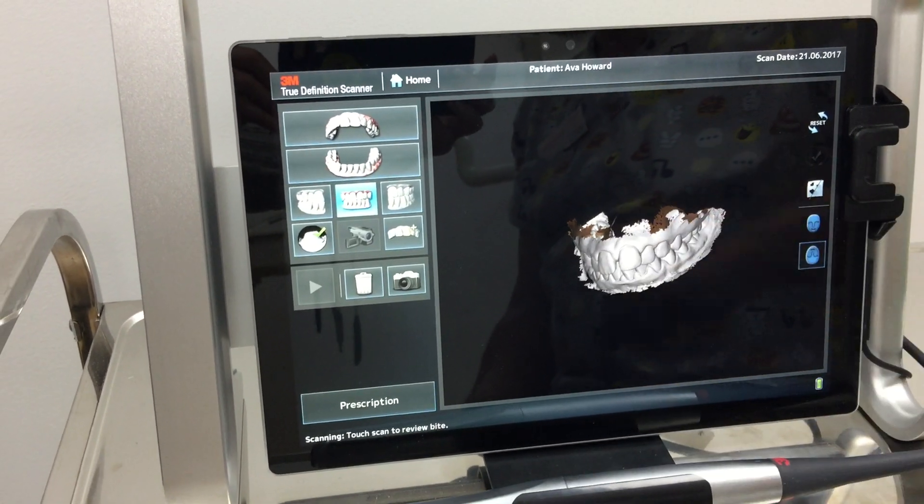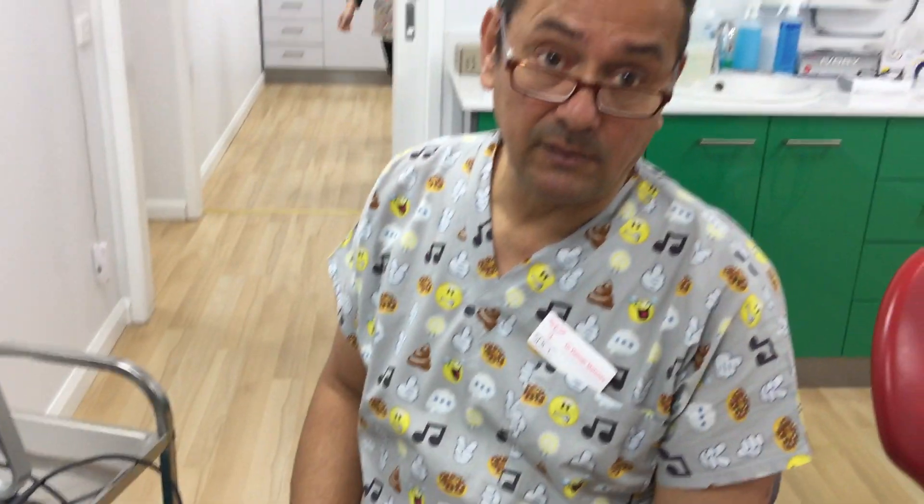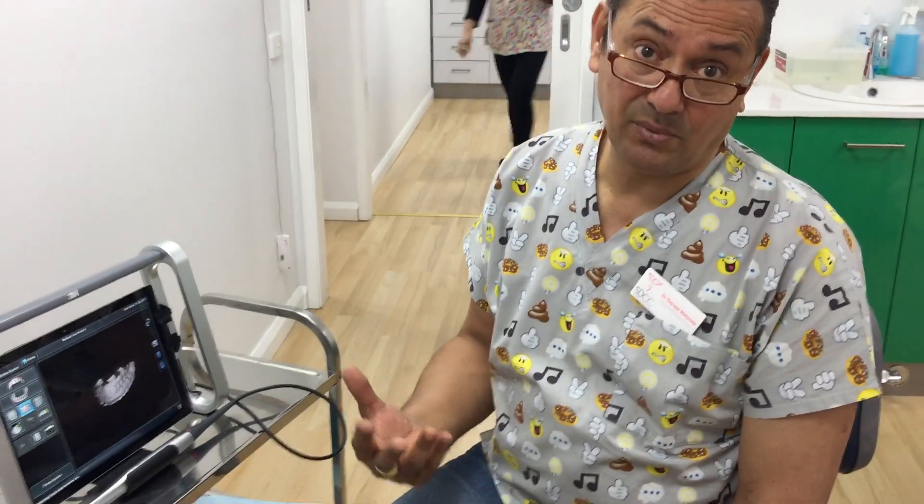So now we just upload this to a center, which gets uploaded to our aligner technology or our crown and bridge workflow. And that's it — that's just what I wanted to show you.